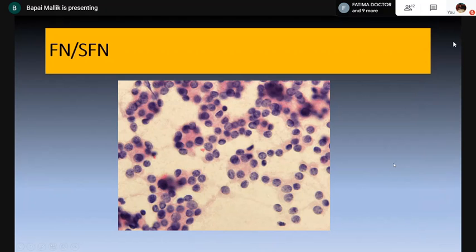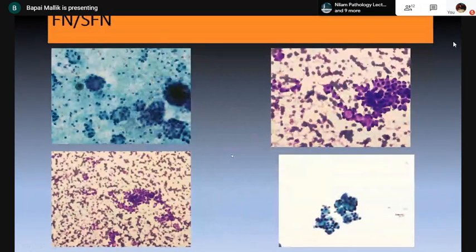But you might possibly see one more case like this. This is a case which we saw very recently. As you said, we had a number of microfollicles, and then in between you have got kind of a secretory material, but they're all thyroglobulin. We did some immunostains, and the stains were all thyroglobulin positive, calcitonin was negative. We'll be dealing with the immunostains a little bit later on.